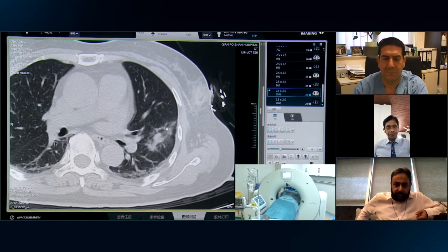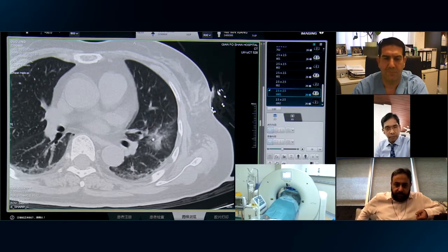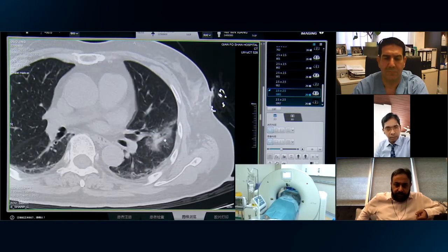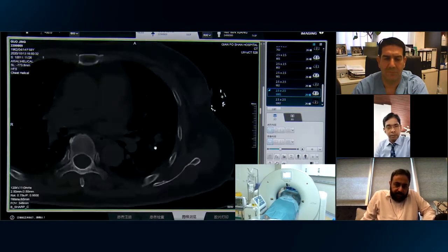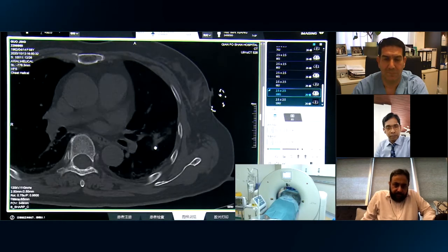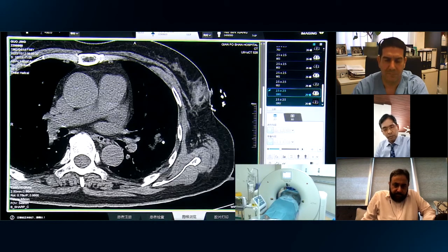Yeah, we can see the boundary of the reactive GGO of the ablation. The GGO fully covered the lesion. You can see it clearly. Yeah, in bone window, you can see the lesion is in the center of the cavitation.